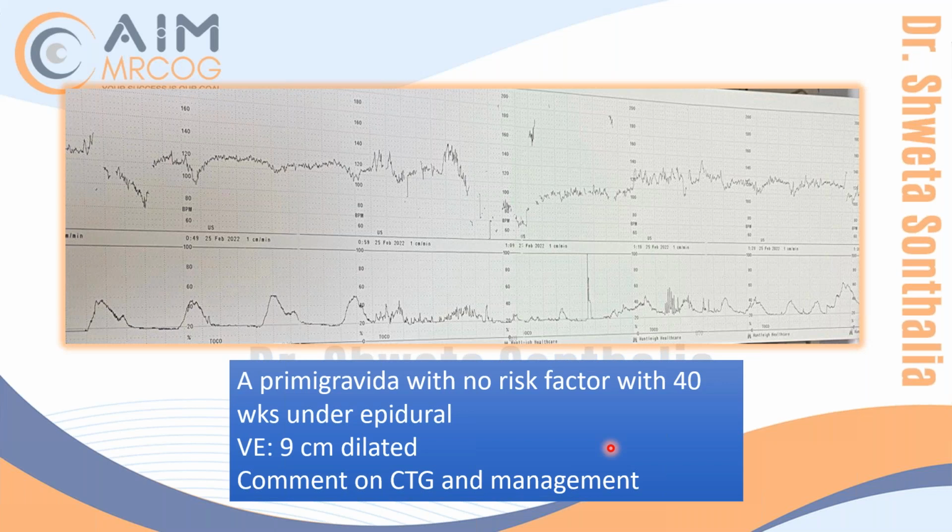The baseline started from 130 and then goes sometimes to 110, this is 120. Is it reaching down anytime? No, we are still on baseline.